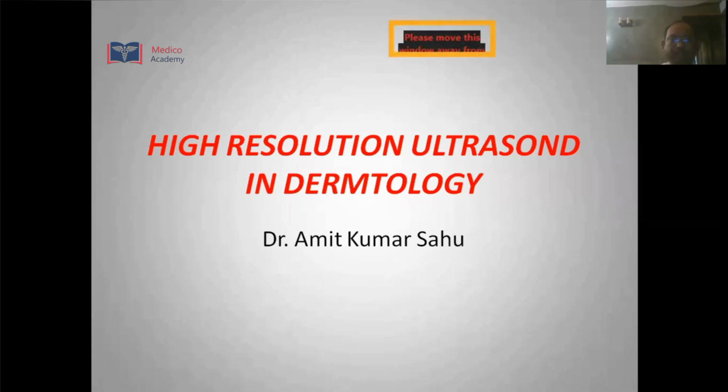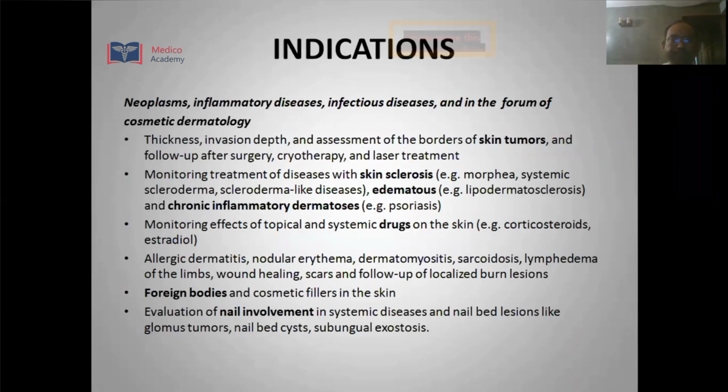So now we will be discussing the role of high resolution ultrasound in dermatology. This is a very interesting topic, and recently a lot of work has been done on this, and we will see how ultrasound is being effectively used to diagnose some of the cases in the skin.